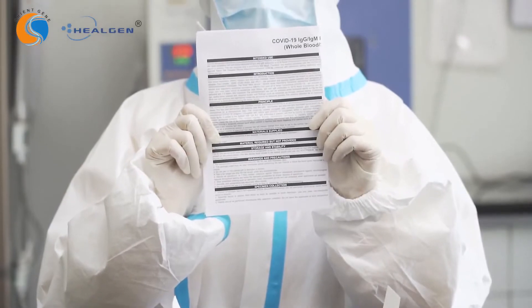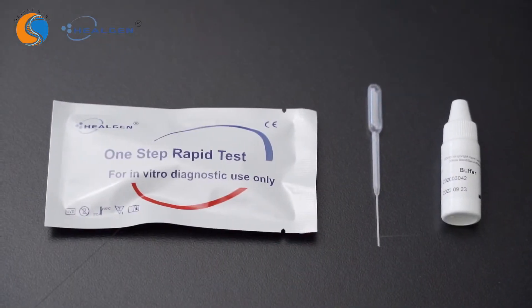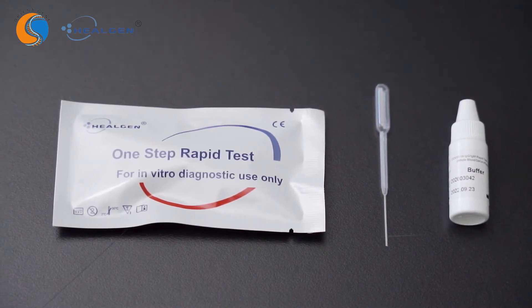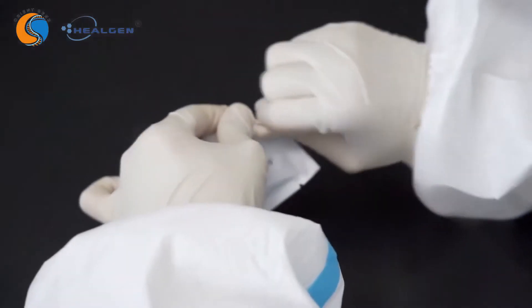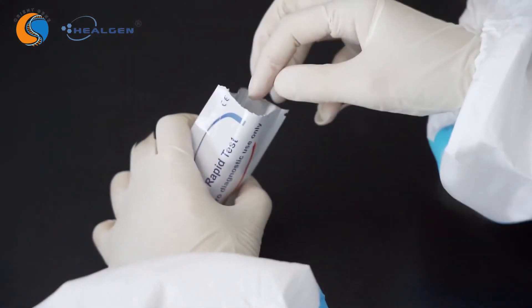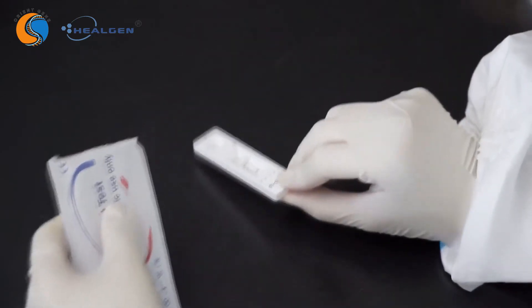Read the package insert carefully before use. The kit is composed of the test cassette, buffer, and dropper. Allow the test materials and specimen to reach room temperature before testing. Remove the test cassette from the sealed foil pouch. Do not open the pouch unless you are ready to begin the test. Place the test cassette on a dry, flat surface.